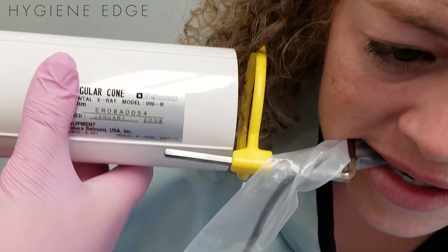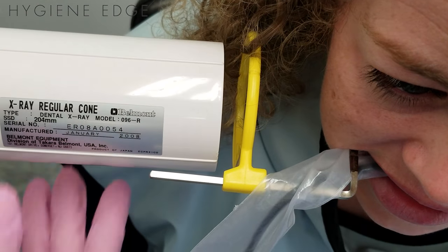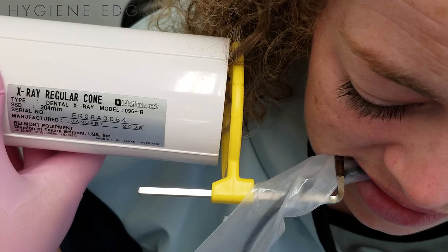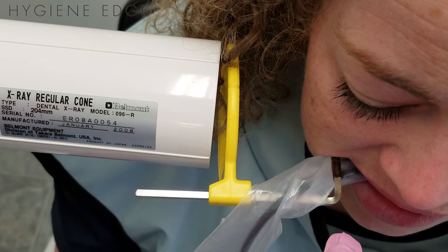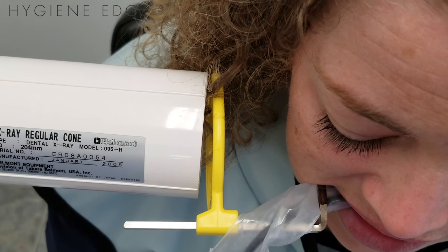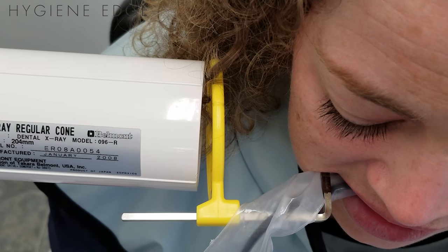If I line up the tube head with the ring, I'm going to have horizontal angulation issues. So I actually just line it up with the plane of the teeth instead. It's going to be off your ring a little bit, which is kind of weird at first, but that'll make sure you have great contacts.